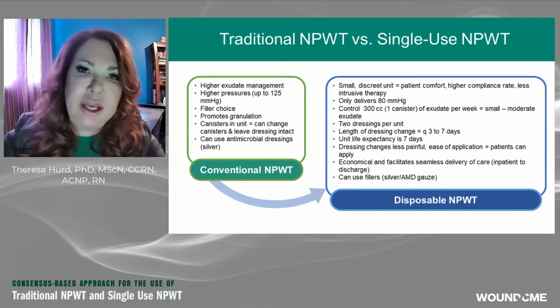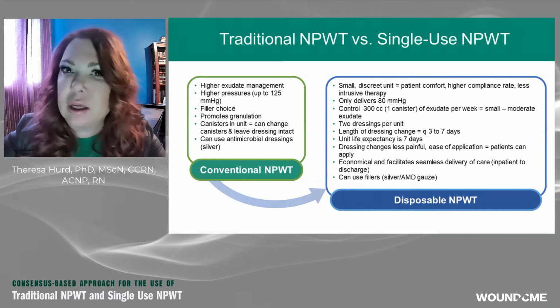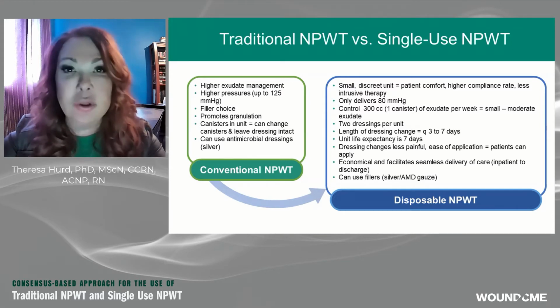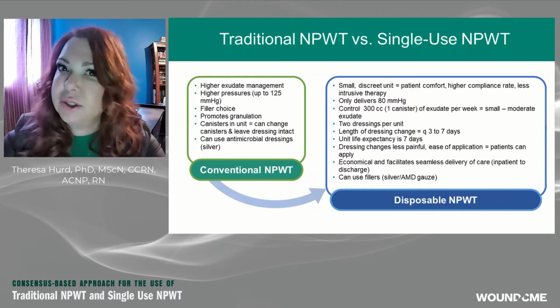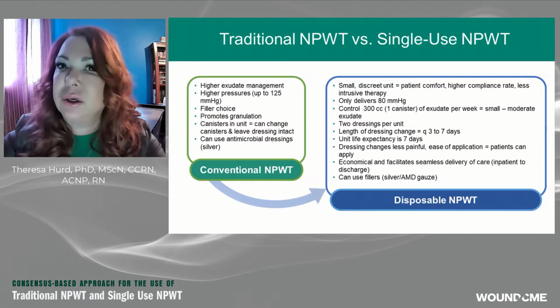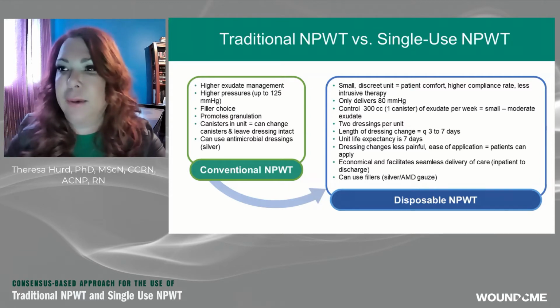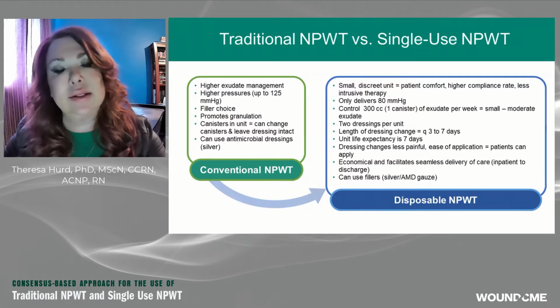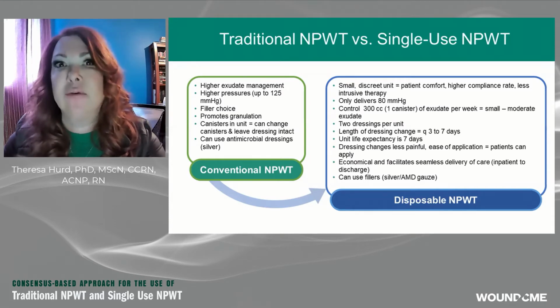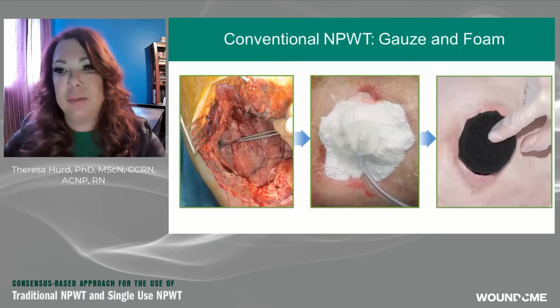So all things equal, the question comes, which one do I use? They both give us negative pressure. And this is where you start to use your clinical skills and your assessment of the patient to make a decision, which one is better for my patient. If both of them are negative pressure, then you start to take in things such as financial, efficiency, cost, and patient compliance, or how impactful the treatment will be on the patient.